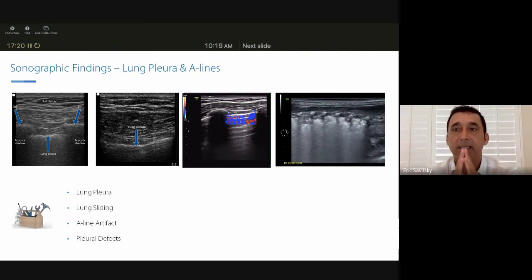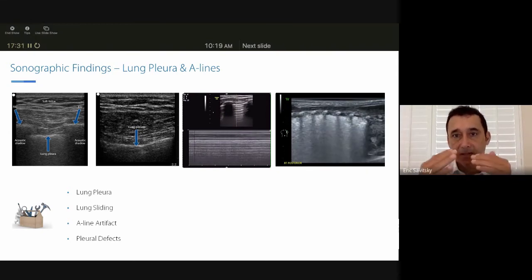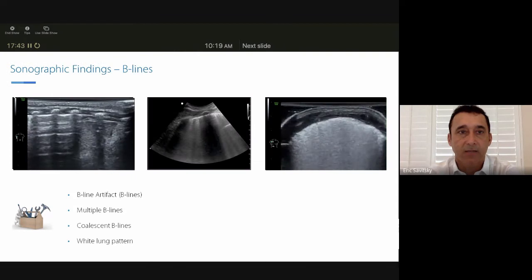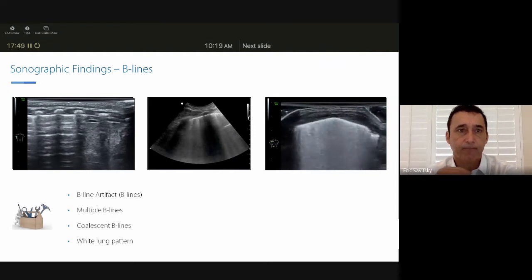And that's indicative of pathology of the subpleural region of the lung, where there is loss of aeration, and the ultrasound signal penetrates through the pleura and through the lung immediately underneath it due to that loss of aeration. And you wind up losing the visualization of the pleura, and that's indicative of pathology. So that's what a pleural defect, in this case, multiple pleural defects look like.